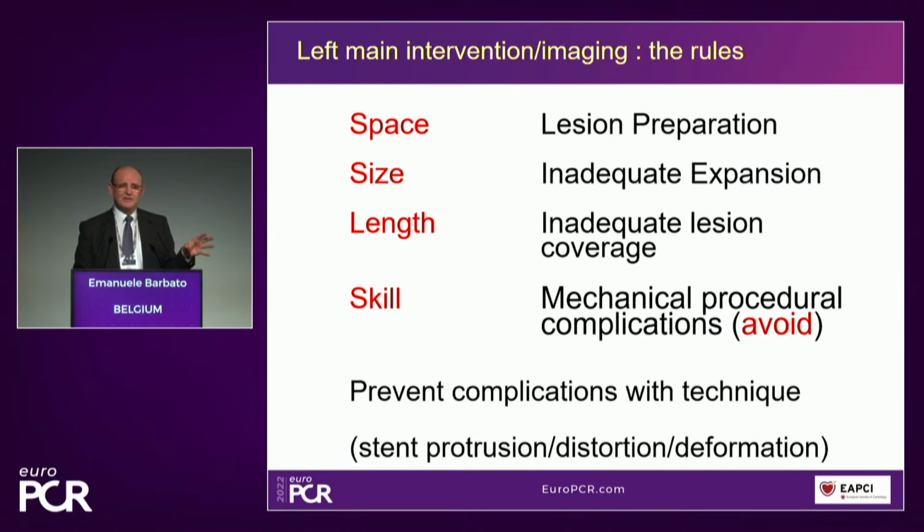And skill means that you don't make a problem, for example, longitudinal deformation of the stent, and you can, with skill, prevent complications. But ultimately, if we use this guideline, then our procedures will be better and our patients will thank us. Thank you very much.